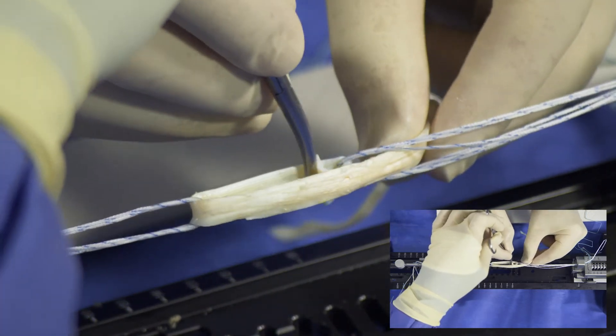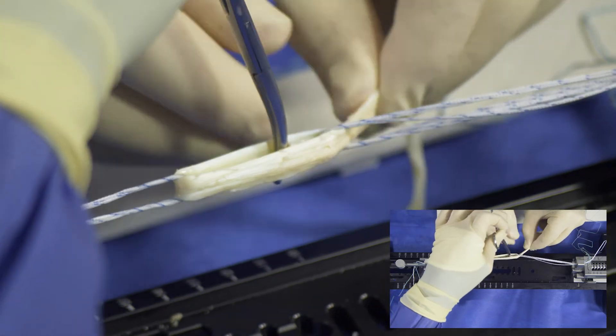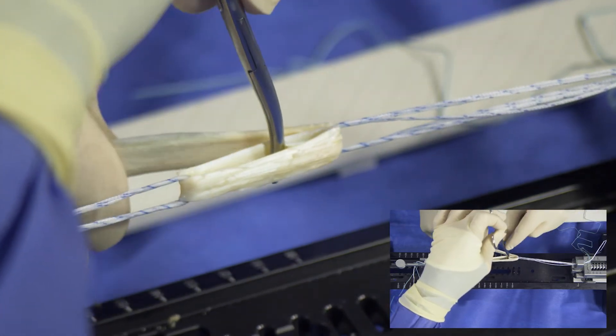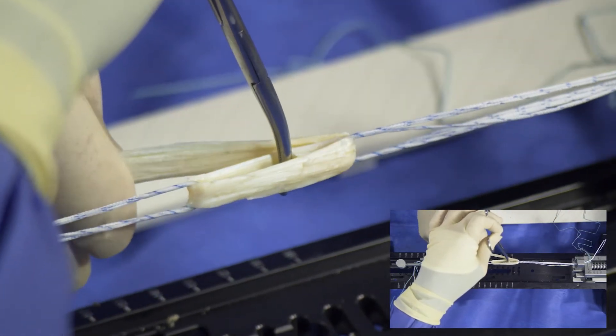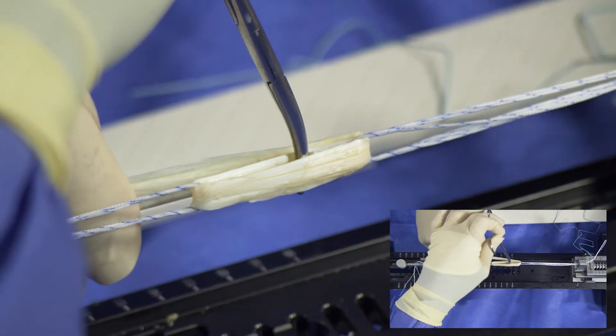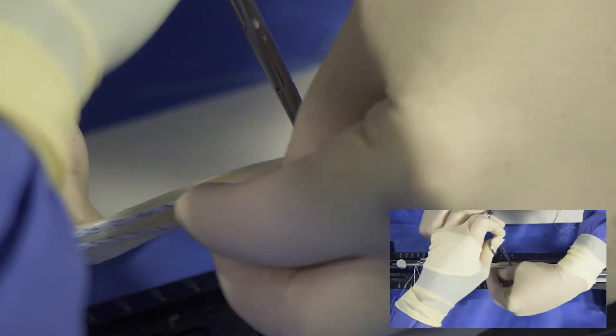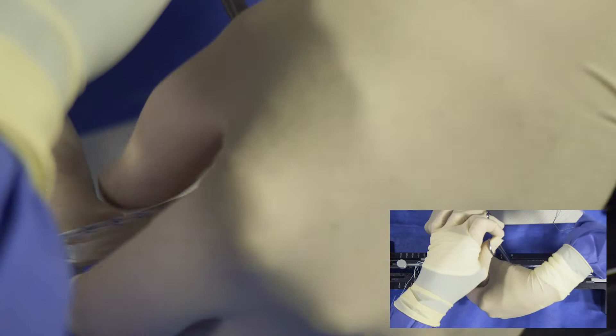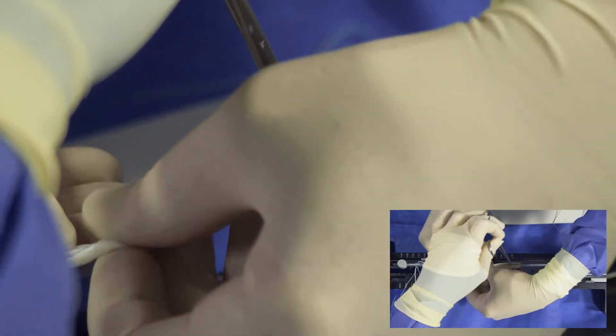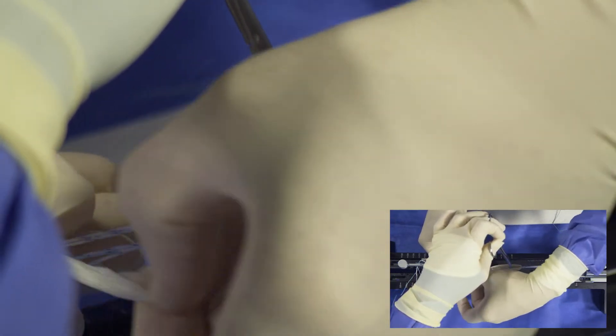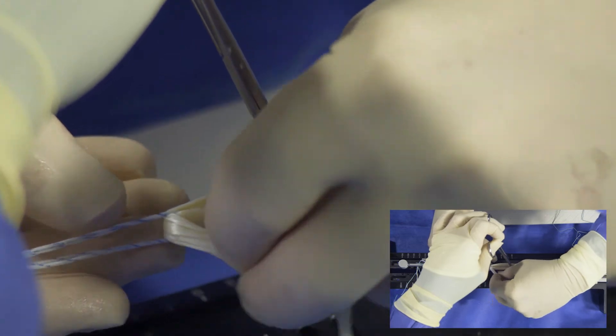Our goal is to have a continuous loop of tendon, four strands, that overlaps at its beginning and end by about 12 to 15 millimeters. Typically, the graft length for someone five feet tall would be in the 56 millimeter range and someone six foot two, 70 millimeters.